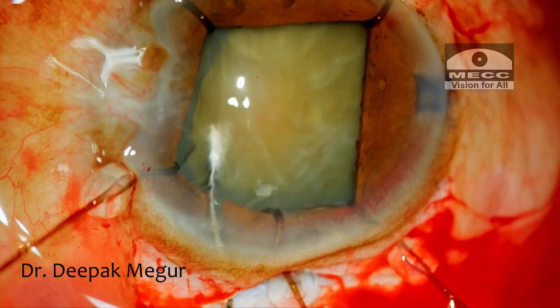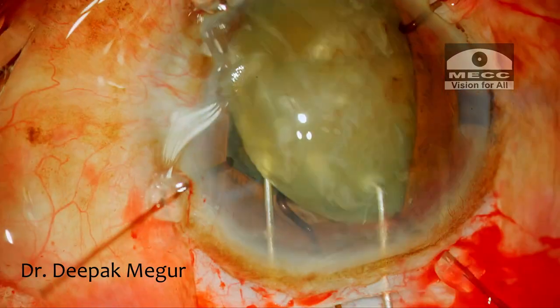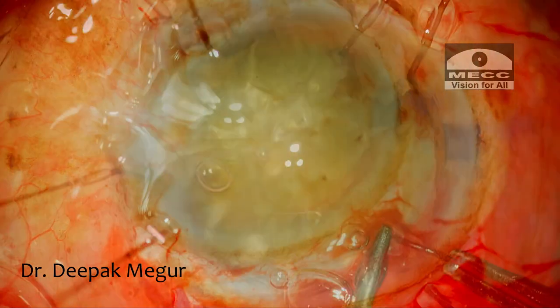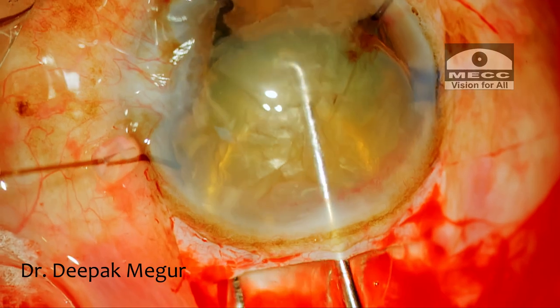Hydrodissection is performed. The nucleus is delivered bimanually out of the capsular bag. The two superior hooks are removed. The nucleus is delivered out using the phaco sandwich technique.